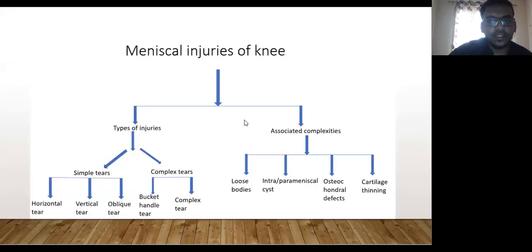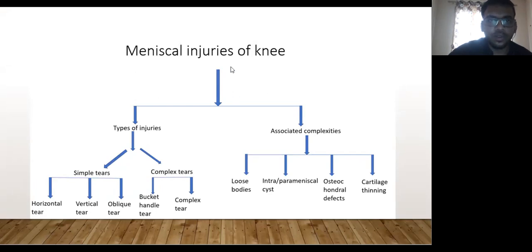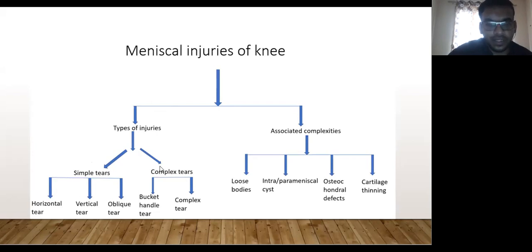The menisci are semilunar fibrocartilages that are triangular in cross-section, present between the medial and lateral condyles of the tibia and femur. They play a crucial role in stability and knee kinematics. Meniscal injuries are usually seen in a flexed knee — typically 10 to 20 degrees of flexion — whenever there is a twisting injury. Injuries are divided into complex and simple tears: simple tears include horizontal, vertical, and oblique tears, while complex tears include bucket handle and complex tears. Associated complications include loose bodies, intra- and parameniscal cysts, osteochondral defects, and cartilage thinning or loss.